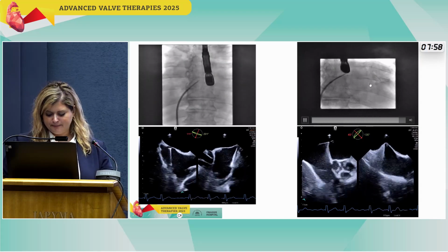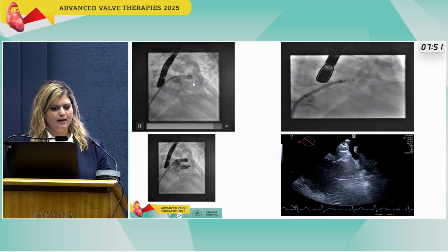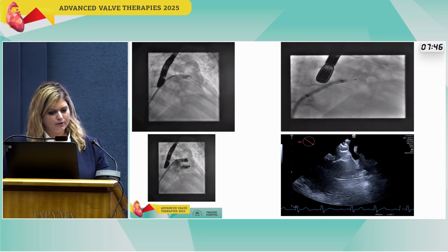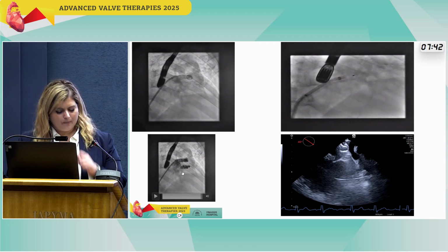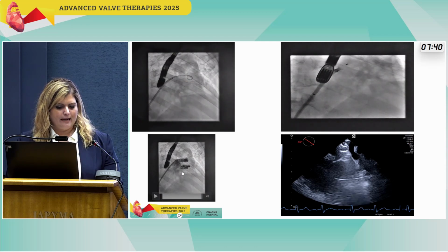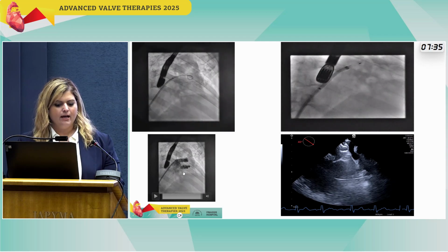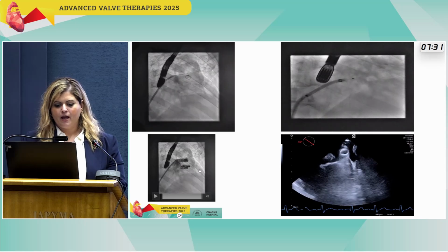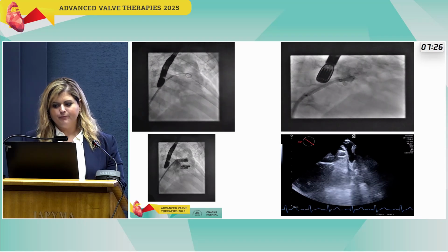Afterwards, through the catheter, we insert a pigtail catheter in the LAA, where we flush contrast agent, and with this flush we can measure once again the length and the LAA ostium area, in order to be sure that the device that we selected is the correct one. We did select in this patient an Amulet 25.